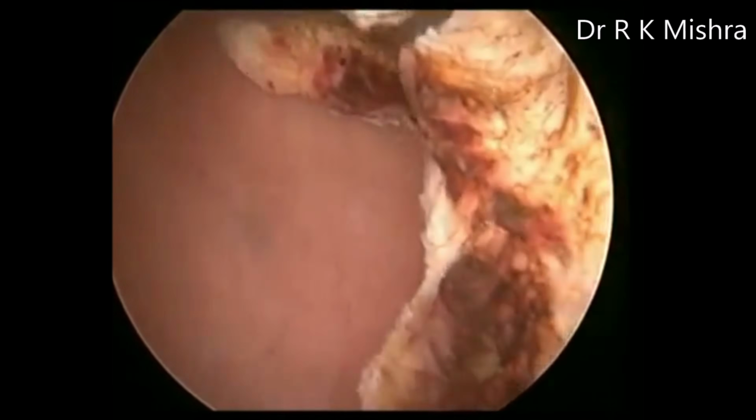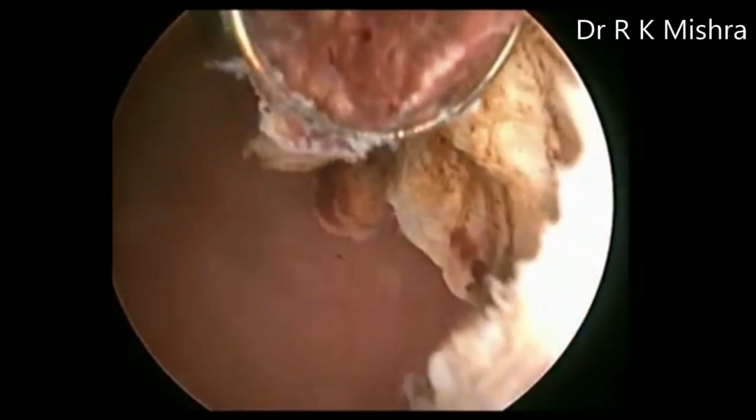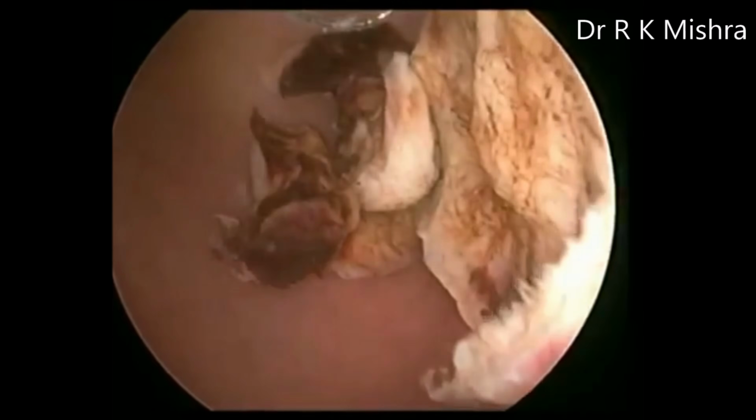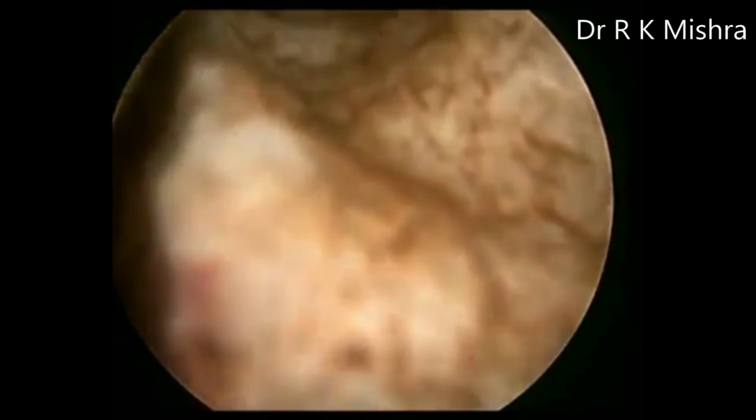However, how much wattage you are using also depends upon the frequency of your electrosurgical generator. If you have a high frequency generator, you can use less wattage, but a low frequency generator needs more wattage. And slowly this resection should be continued.